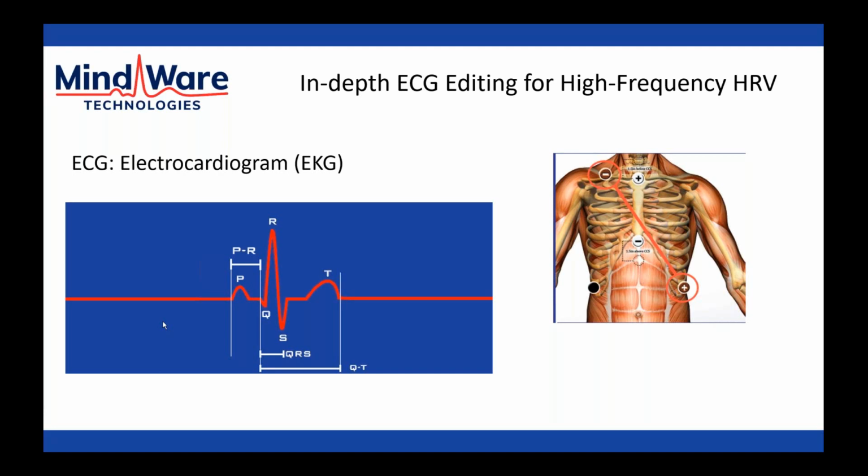And then finally, we have repolarization with the T wave following the QRS complex. We're almost always going to see a T wave as well. We don't use it to identify beat-to-beat timing because it is a little more rolling in nature. It has some clinical implications, but for our purposes, we want to see it just so that we can confirm that the beat is indeed normal in timing. And so you're almost always going to see it. And I'll show you some examples later of what a good T wave looks like, and also what one might look like when there's some sort of cardiac arrhythmia taking place.